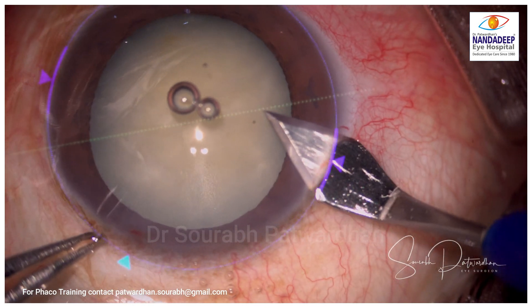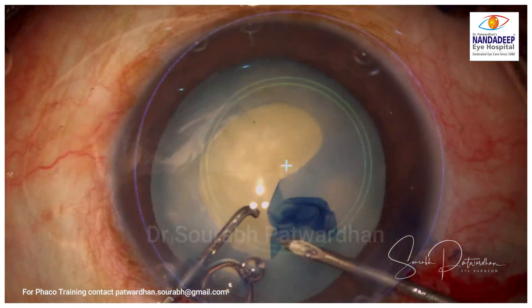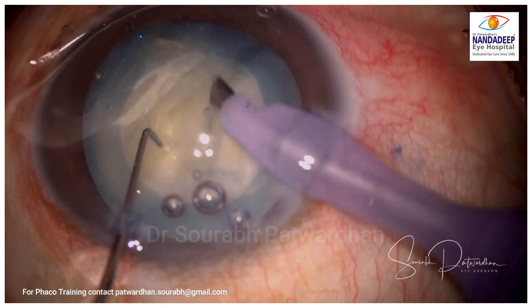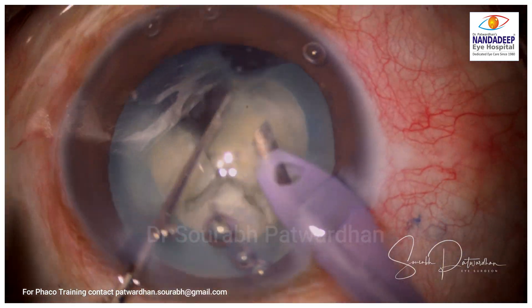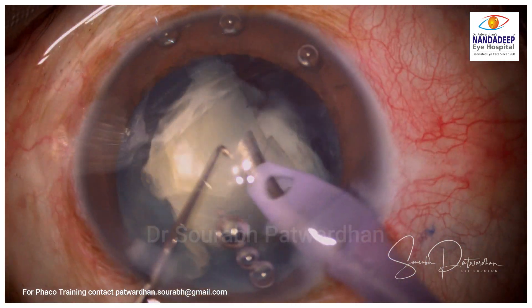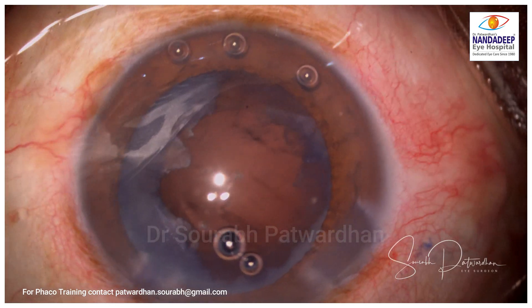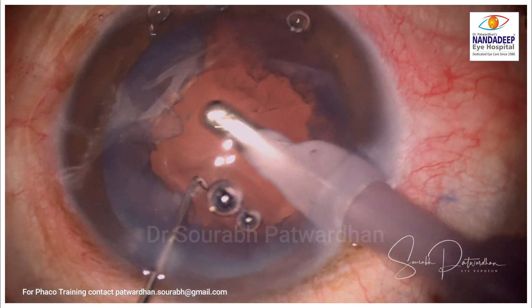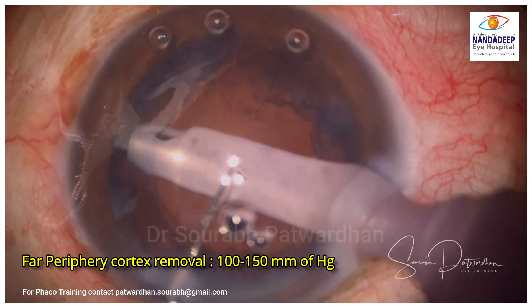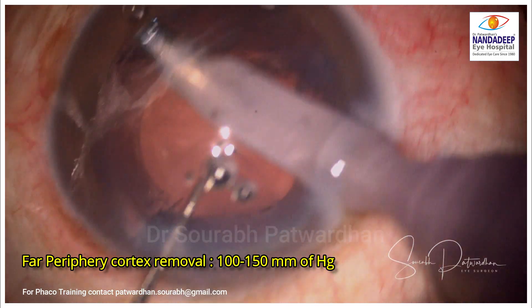How do you polish the bag? This is a case of a mature cataract — a soft one — and without any complications. The plan is to do phacoemulsification. In these cases, mature cataracts with a soft nucleus leave a lot of cortex behind. In immature cataracts you can pull out the cortex from its anterior part, but in these cases the cortex left is in the far periphery under the capsule, so you cannot really pull it out unless you go in with your probe right into the periphery.